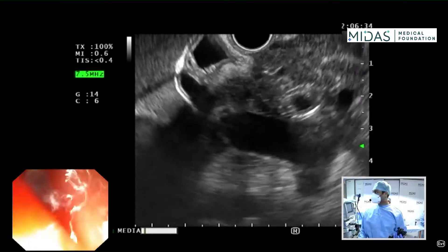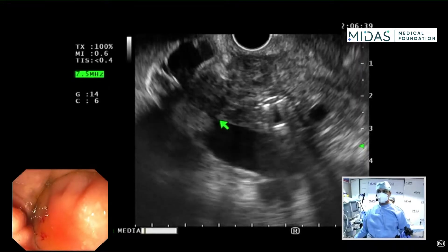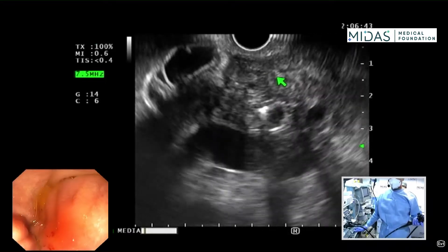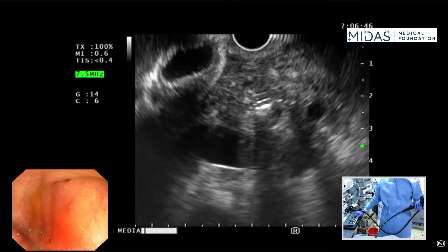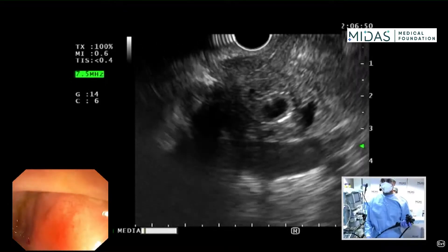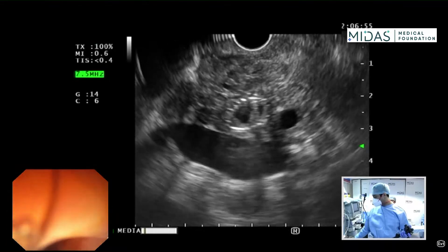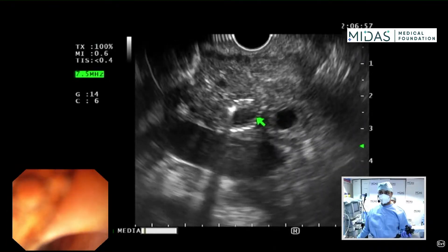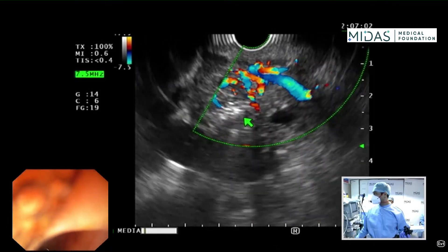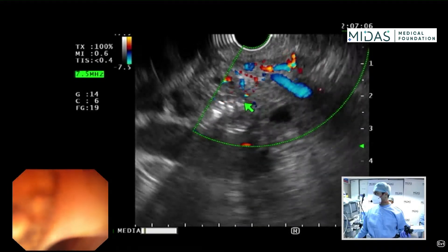Now what you immediately see is the head of pancreas structure — I'll use my cursor to point it out. What you see on the screen is the head of pancreas. You can also see a hyperechoic metal stent right there in the bile duct. You can use flow to show this is the pancreatic duct, which also appears very prominent, and a few vessels here.